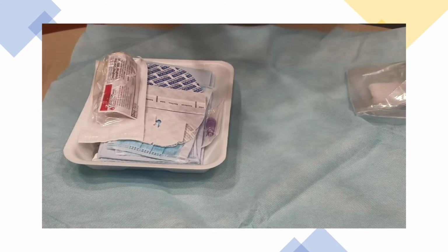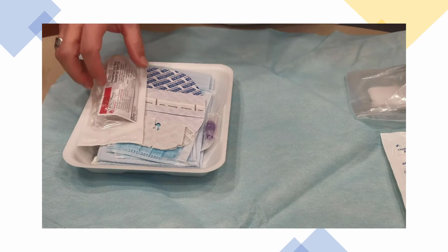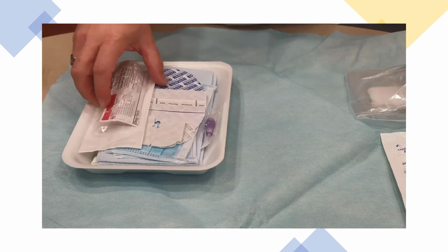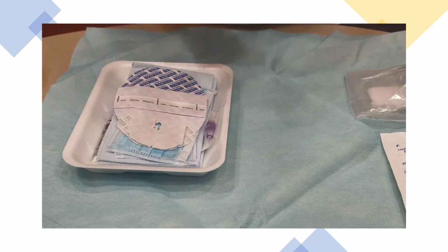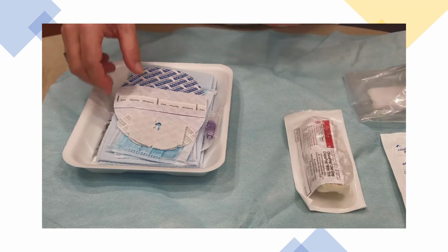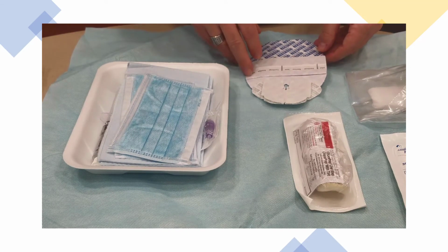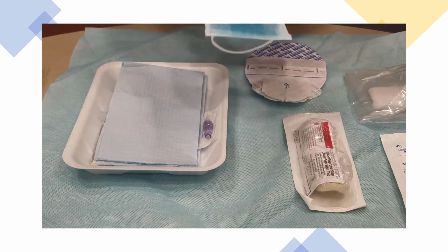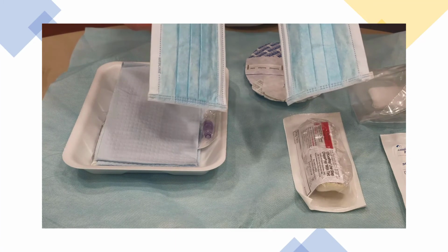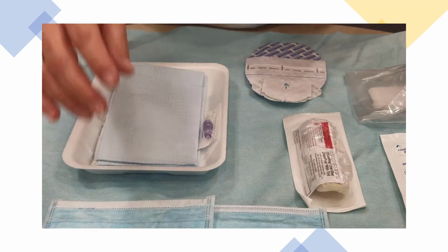Comes with a pair of gloves. The gloves are one size, so you may have to go to the supply cabinet and get a size that you can fit. We have your ChlorPrep, which is very similar to the ChlorPrep in the insertion kits for IVs. We have the dressing. It comes with 2 masks, one for the patient and one for us.